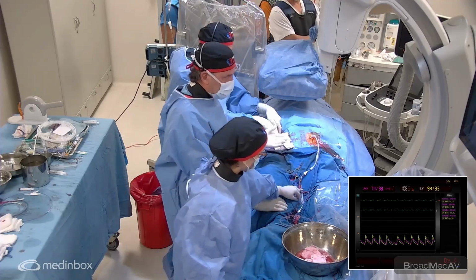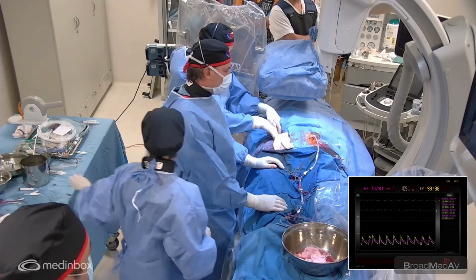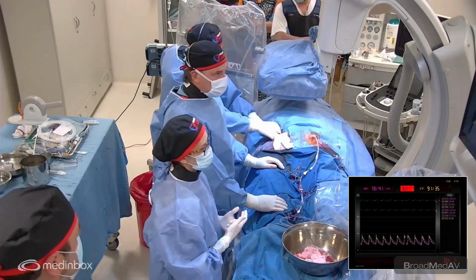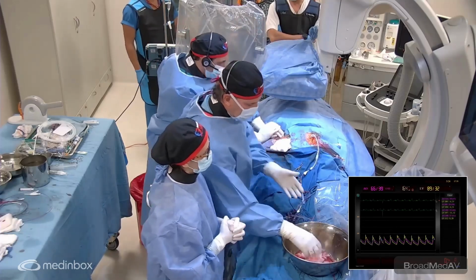So although we have a valve in a correct position, although we have a balloon expandable valve, this is a patient that for safety cannot go home tomorrow for sure. So saying that, I would say that this patient is completely finished.